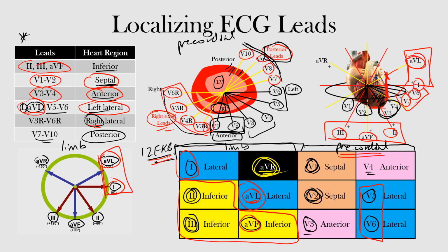Well, that's the end of this lecture. We discussed how the ECG leads are able to localize different regions of the heart and where those regions are located on the standard 12-lead ECG.